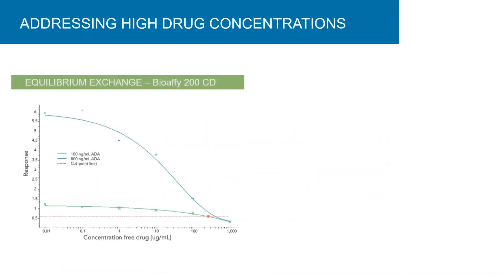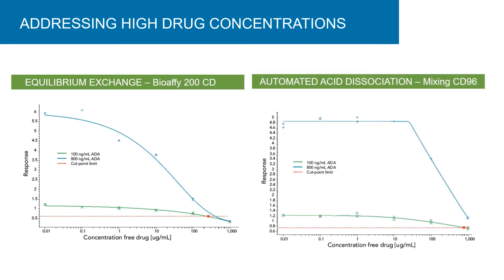This example shows how Gyrolab immunoassay options for minimizing drug interference can maximize assay performance. On the left, an ADA assay showed drug interference at high concentrations where the signal decreased with increasing concentration of free drug for the 800 nanogram per mL ADA assay. The graph on the right, utilizing automated acid dissociation in the mixing CD96, demonstrated linear signal response up to 50 micrograms per mL.